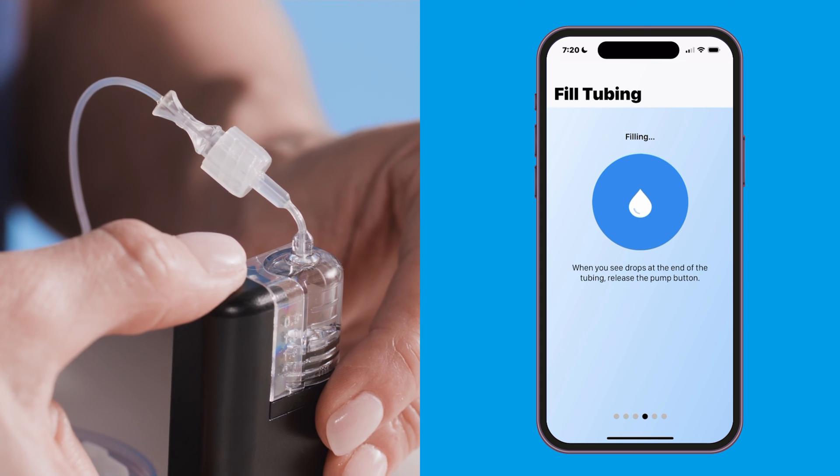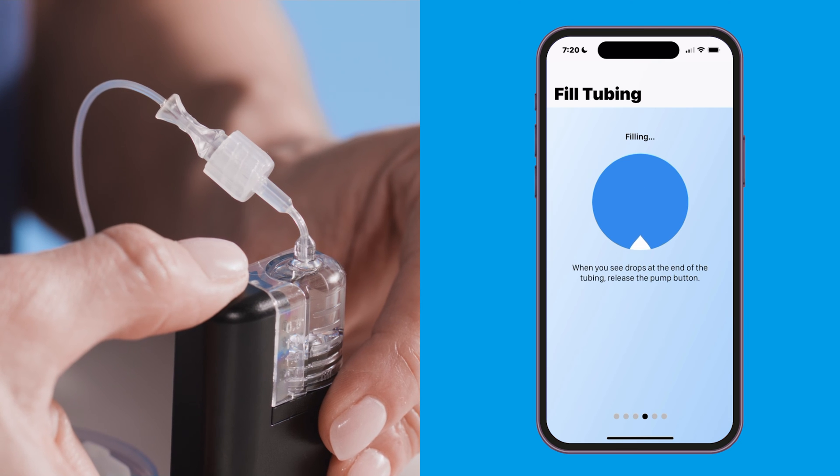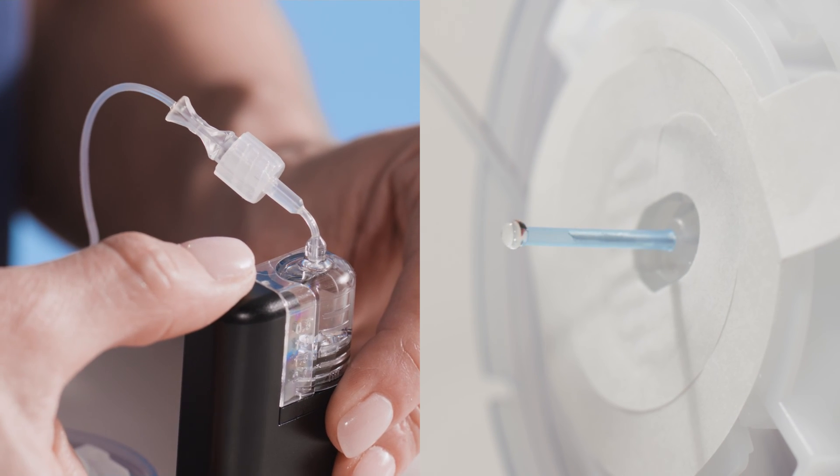Make sure that your infusion set is disconnected from your body, then press and hold the pump button to fill the infusion set tubing with insulin. Hold the pump upright and keep the pump button pressed until you see drops of insulin at the end of the infusion set. This process is much faster with Tandem Mobi than the TSlim X2 pump, so pay close attention. Keep in mind that the pump may pause at regular intervals during the process — this is normal and allows you to check for drops of insulin.